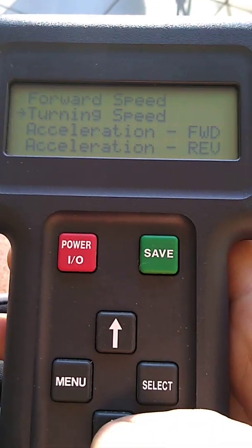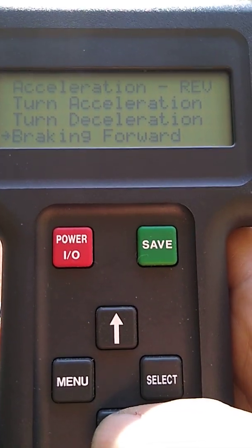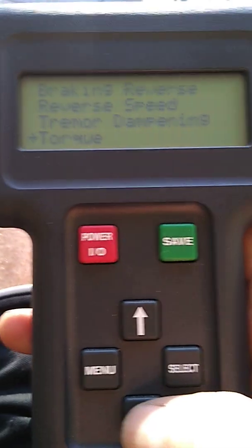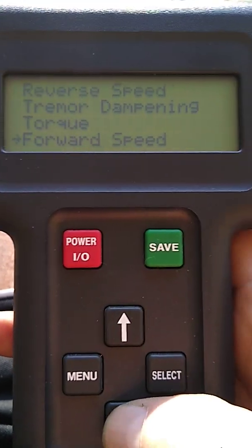Here you can see: forward speed, turning speed, acceleration forward, acceleration reverse — there's a whole bunch of them. I'm not going to go through each one, but here are turn acceleration, turn deceleration, braking forward, braking reverse, reverse speed, tremor dampening, and torque.